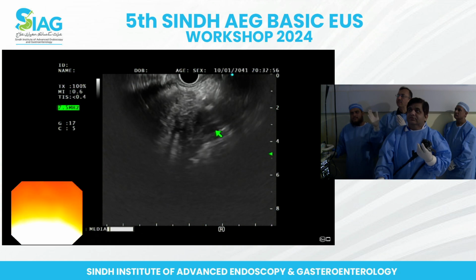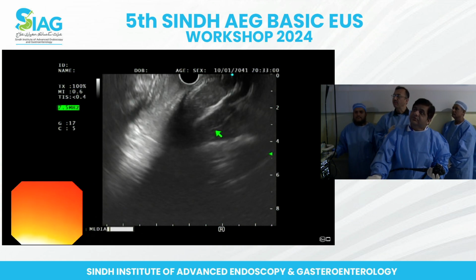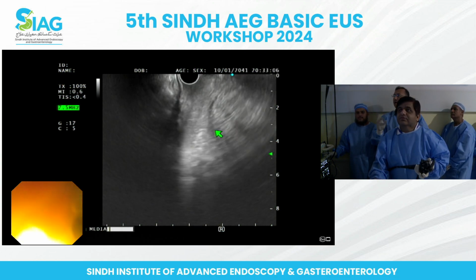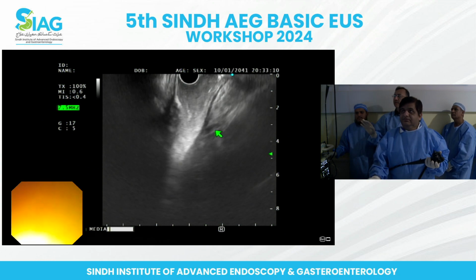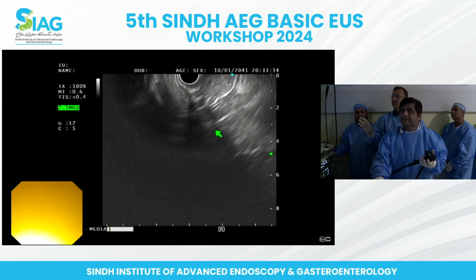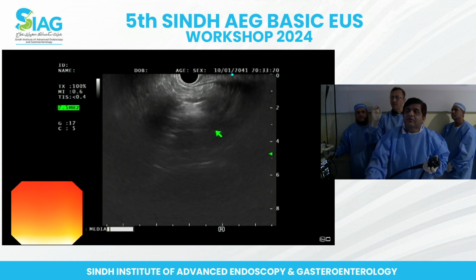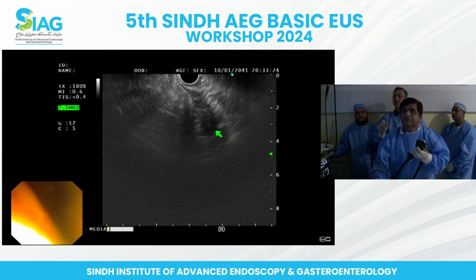So this is your station 1, and these are the things that you are basically looking for at station 1. Now you need to go to the D1. Up till now, other than the stranding and increased echo density, there's nothing. Okay, you need to insufflate a small amount of air, don't over-insufflate the air.